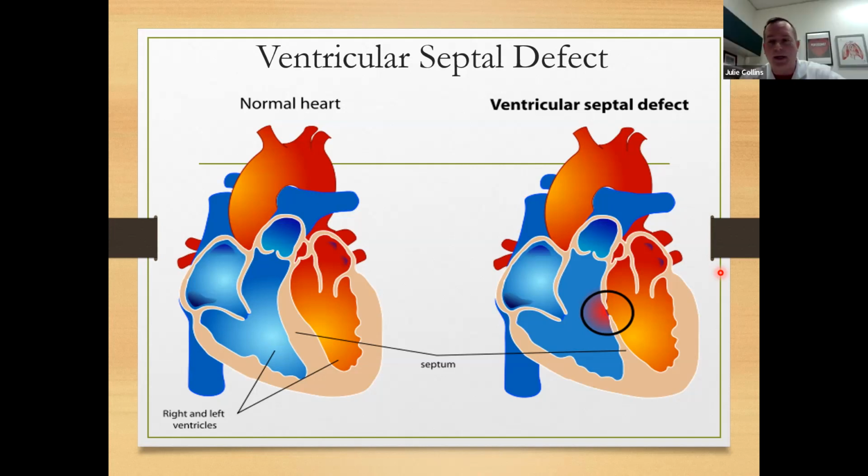And we talked about how the AV canal, while it's still classified as a VSD, it's really an endocardial cushion defect that has multiple issues going on. So what type of venous cannulation? Bicaval. We're obviously going to arrest.